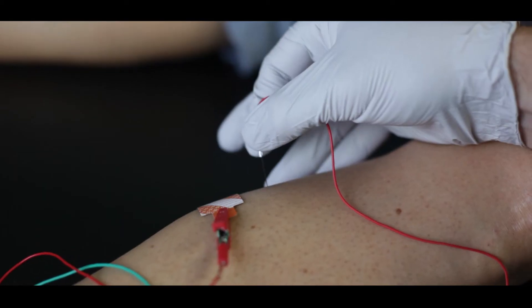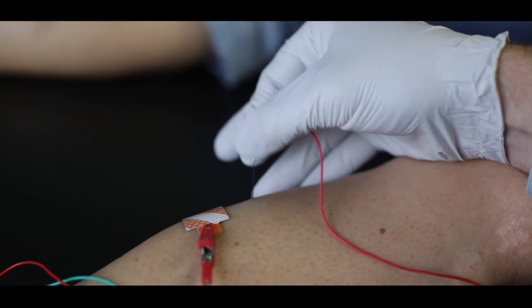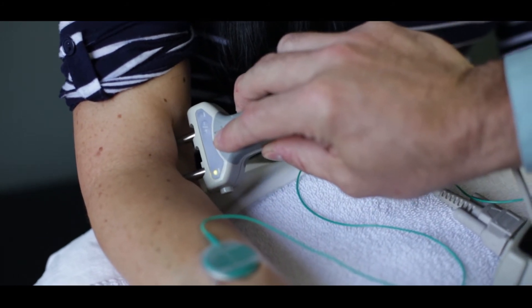Usually, aside from some discomfort associated with testing, you may experience a mild bruise or a bump under the skin, but that is rare and doesn't happen in most patients. One of the main components of electrodiagnostic testing is peripheral nerve conduction.